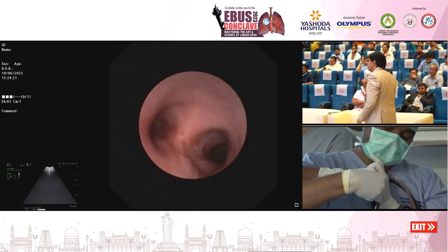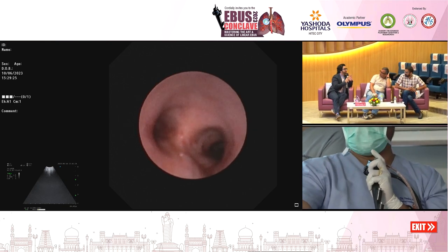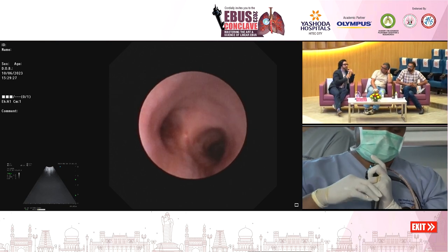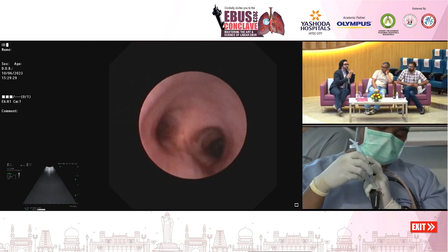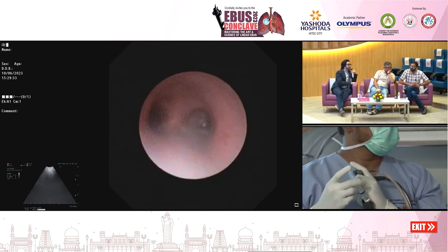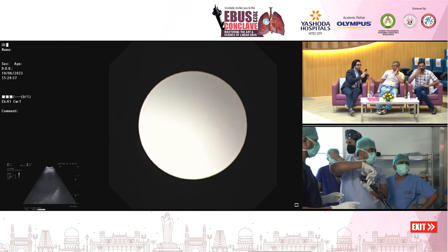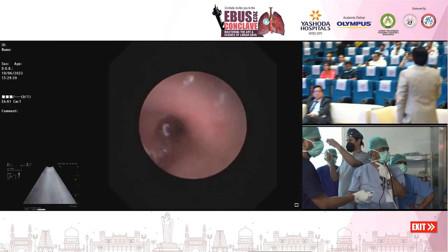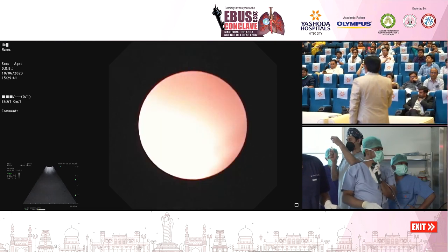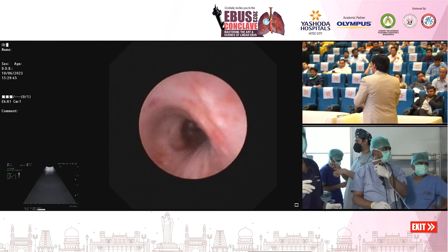So the experts say if you are a beginner, you leave all of these specialized centers. Until we get proper RCTs giving us any proper advantage of actually doing a cryo inside a node, till then we can leave it for the expert to do it and we can attend these programs. I think this is also a very, very important thing. It is not that we want everyone to do it. We have just demonstrated for the sake of completion that all of these are there, can be done.